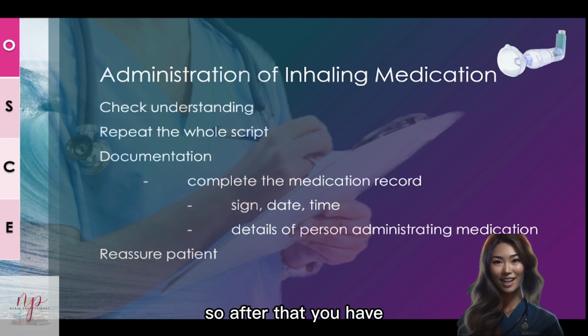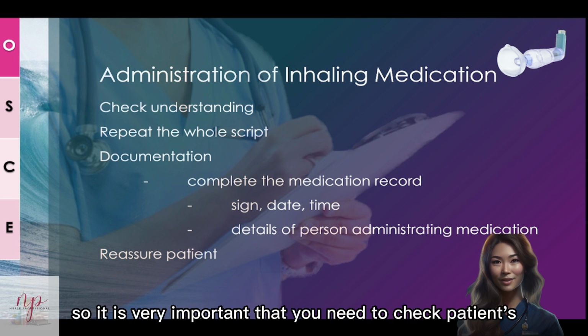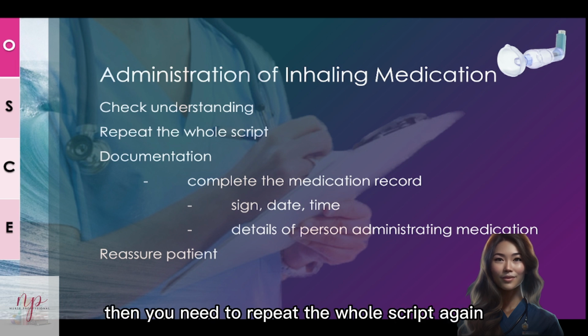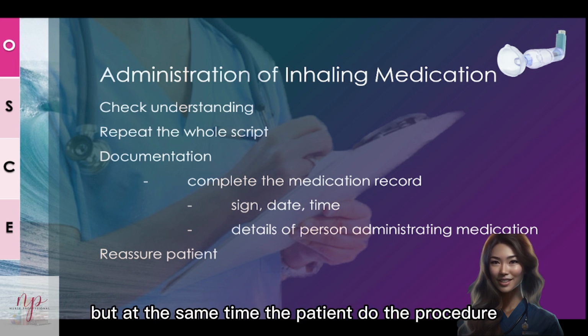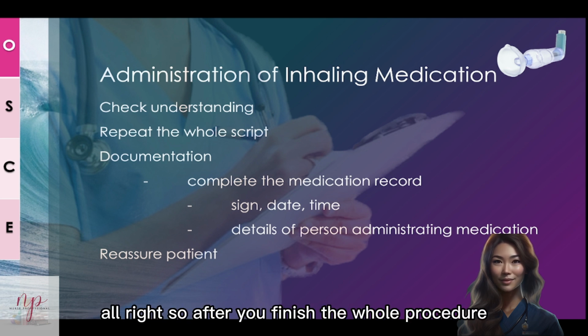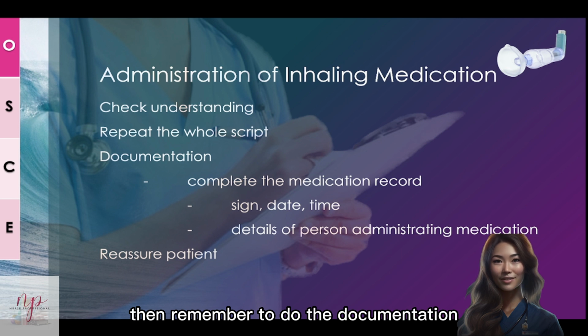So after that, you have explained a lot of things to the patients, so it is very important that you check the patient's understanding. Is the patient following? So you need to ask the patients, alright? Then you need to repeat the whole script again, but at the same time, the patient does the procedure together with you, alright? So after you finish the whole procedure, then remember to do the documentation.